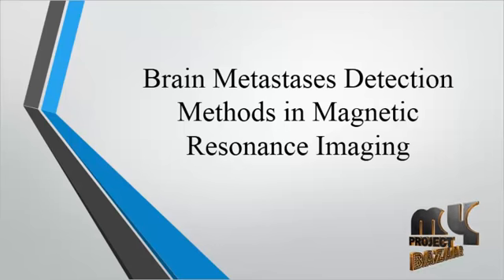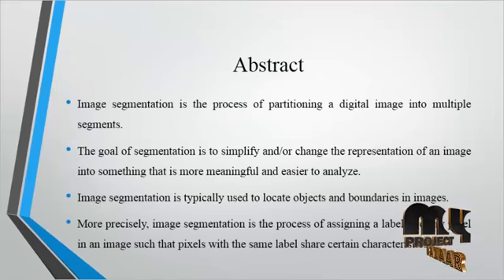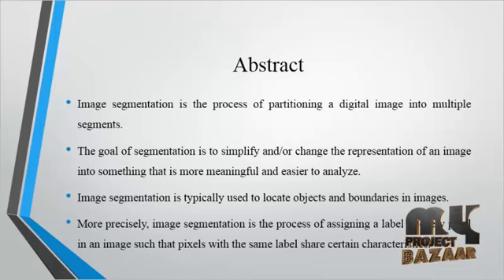Now we discuss the product, brain metastasis detection method in magnetic resonance imaging. Now we discuss the abstract for the process.